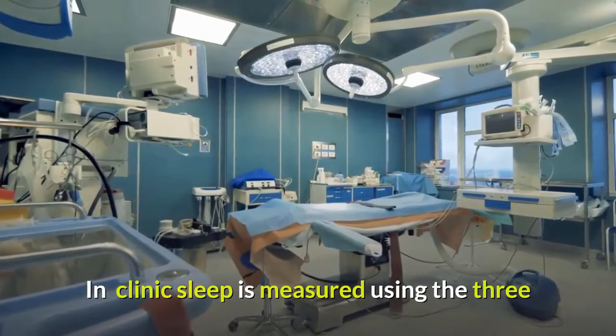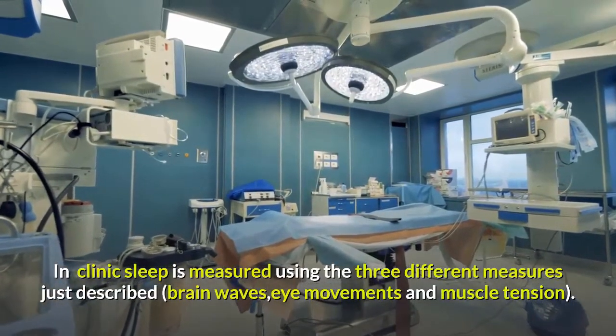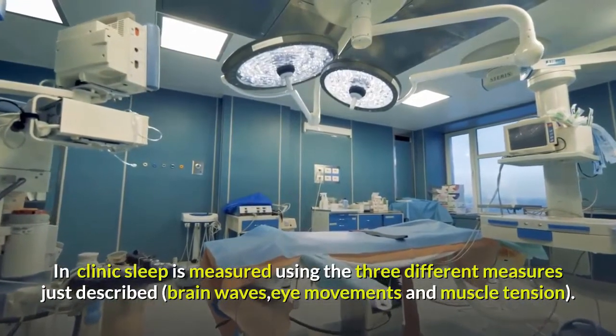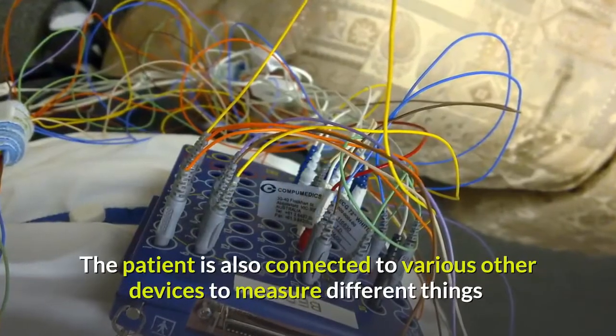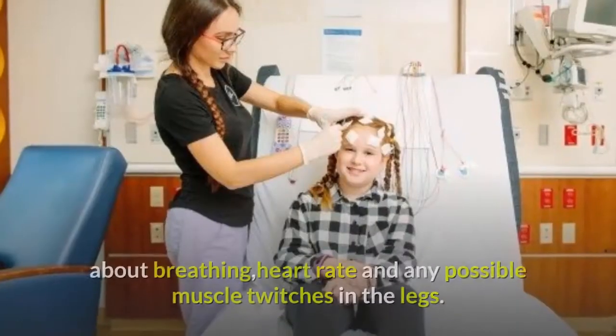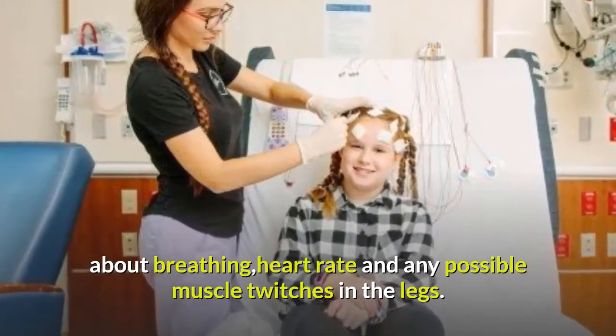In-clinic sleep is measured using the 3 different measures just described: brain waves, eye movements and muscle tension. The patient is also connected to various other devices to measure different things about breathing, heart rate and any possible muscle twitches in the legs.